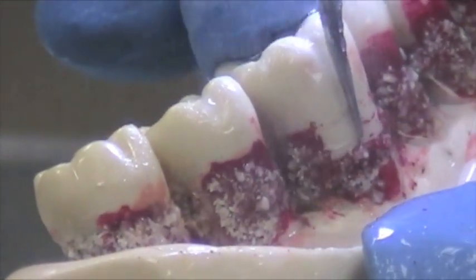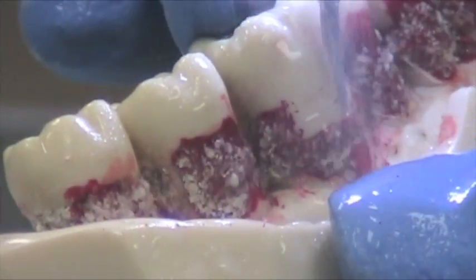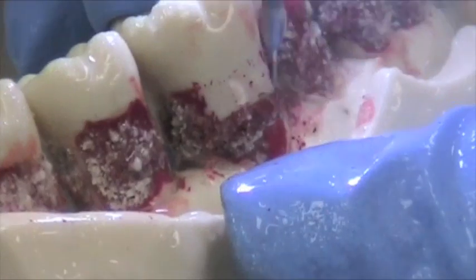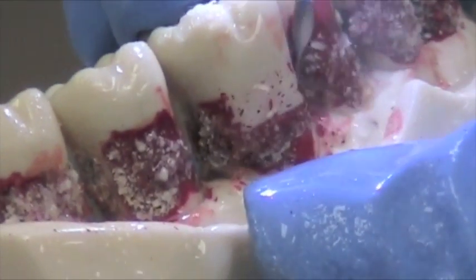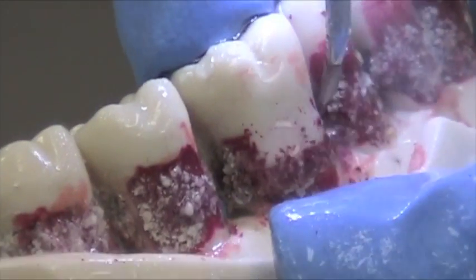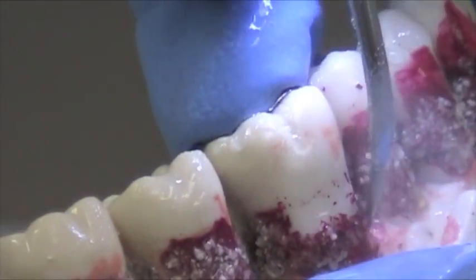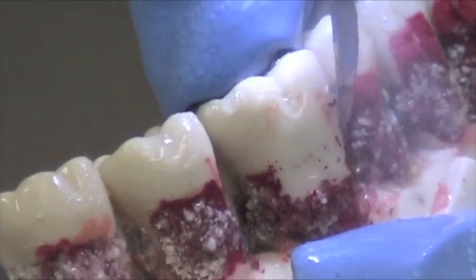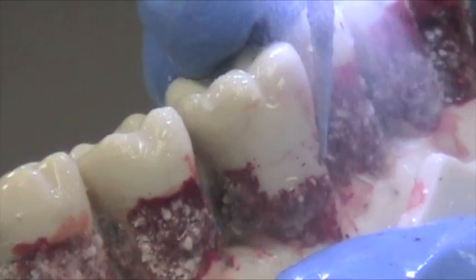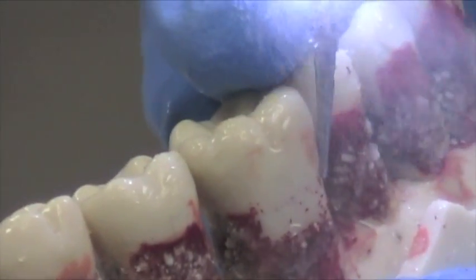Again, you see the sweeping motions — methodical, crisscross — just roll at the mesial line angle so you can go in proximally, starting with the coronal portion and working your way down. Just like with instruments, it's easy to miss a line angle, so you might want to spend a little bit more time when you're at the line angles.